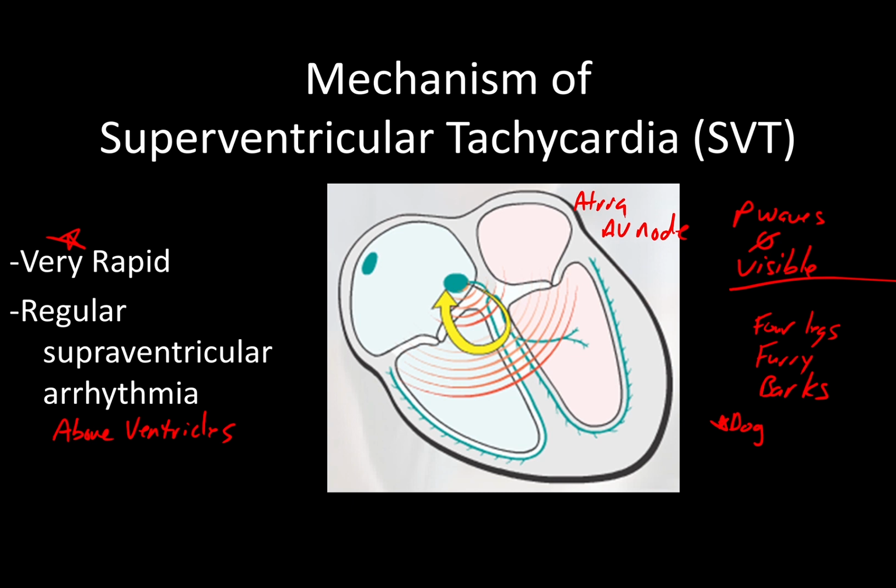In the case of SVT, supraventricular tachycardia, it's the best answer that we can get. You know, we can hear a dog barking, so we know it's a dog, but to be able to tell more from it, it's very difficult.